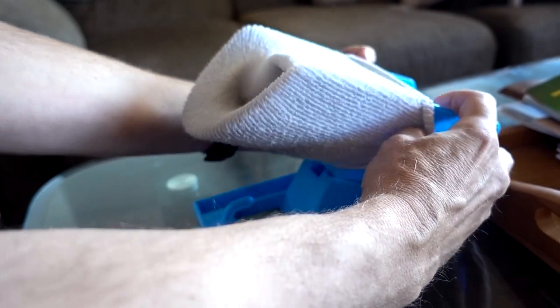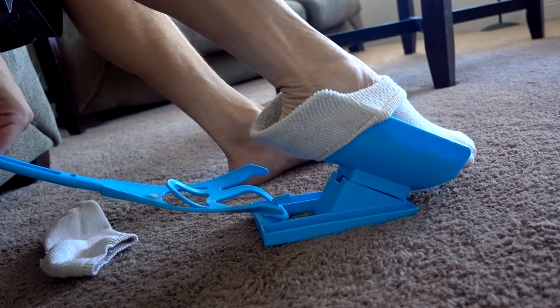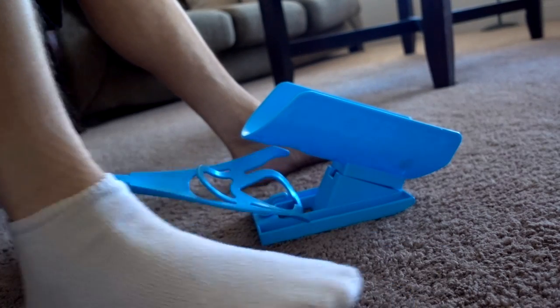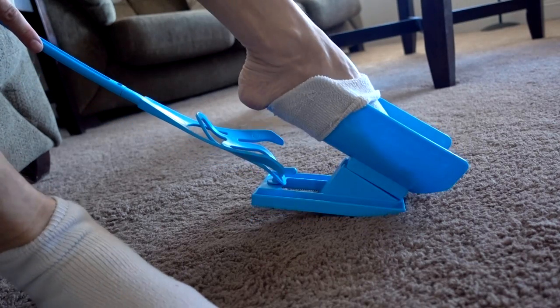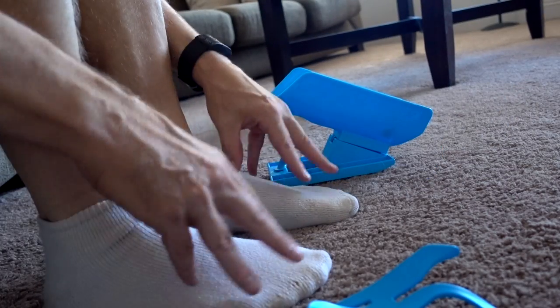Next I'm going to try some short athletic socks that just go to the ankle and see how they work. Okay, that one went pretty good. Try the next one. Short ones went really well.